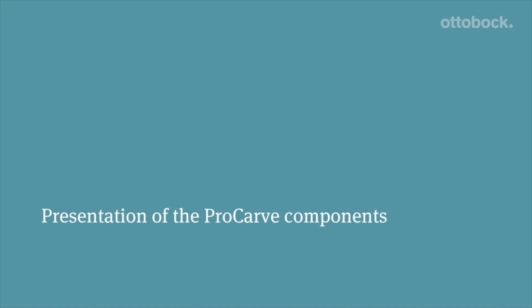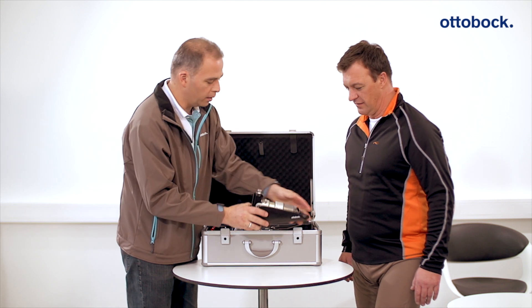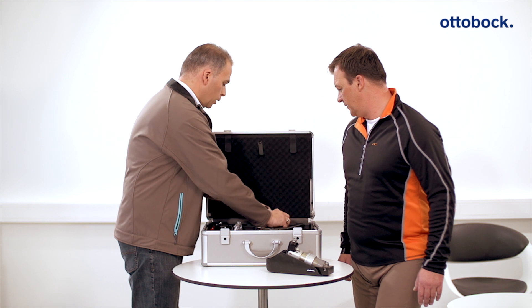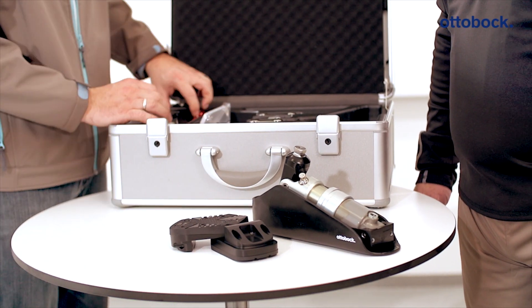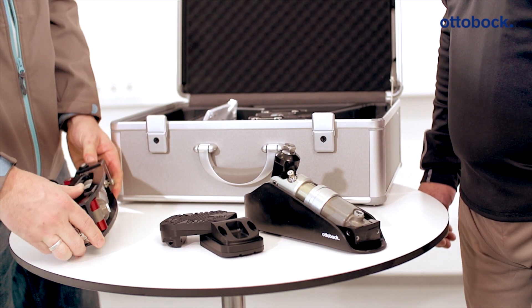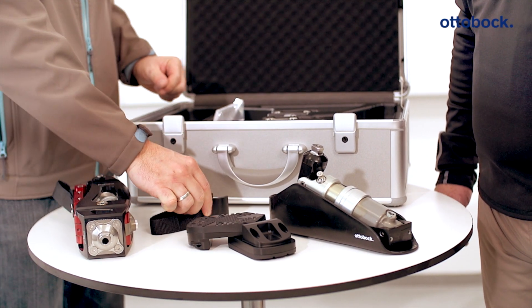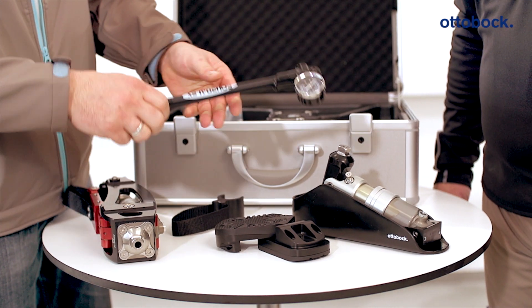The sports prosthesis consists of a foot component with associated attachment parts for snowboard boots or ski bindings, a knee joint including a blocking clip for walking, and a high-pressure air pump for adjusting the movement resistance of the system.